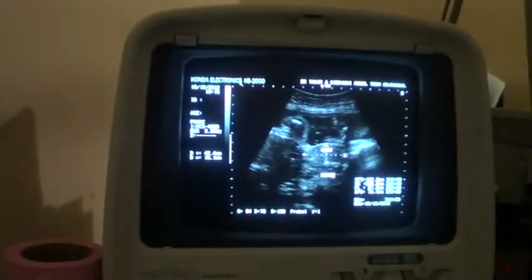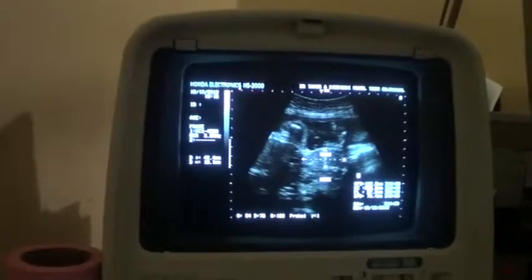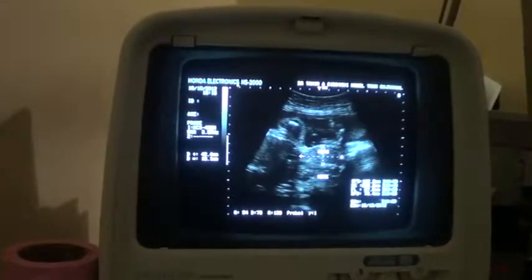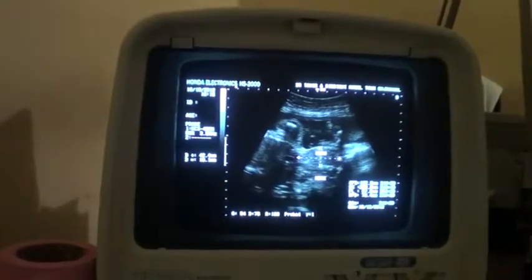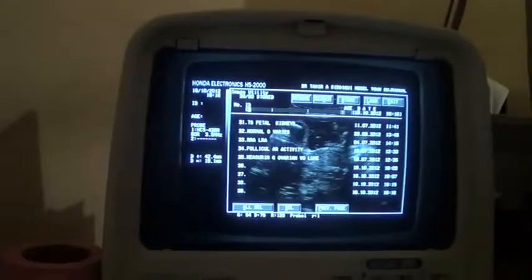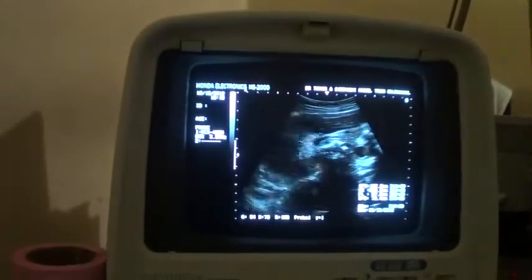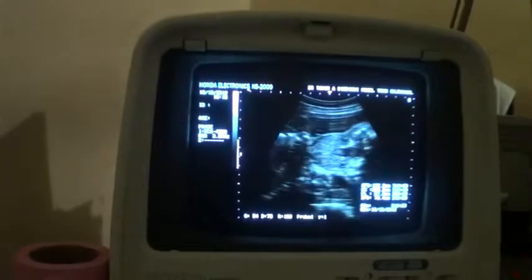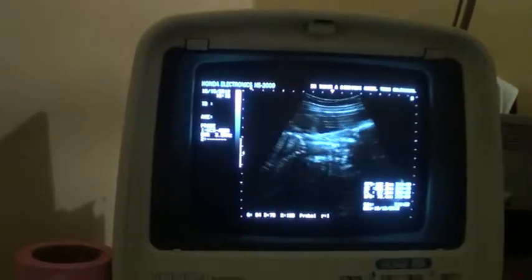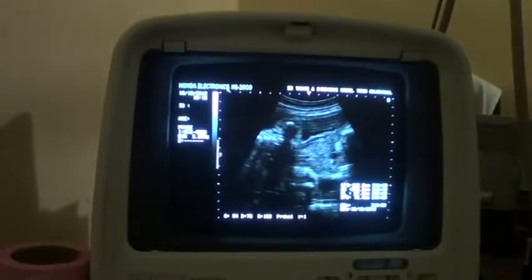Now, it appears to be a thyroid mass. However, the differentials will be significantly much more. See again here. Now, I wish to show you the brain, the mass, and the chest together here.